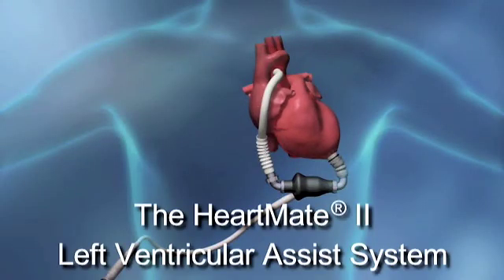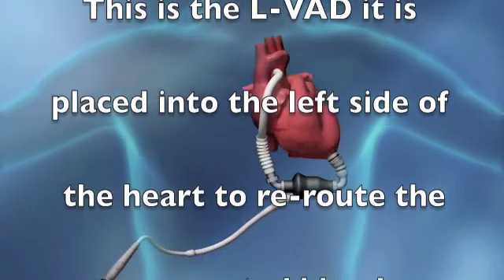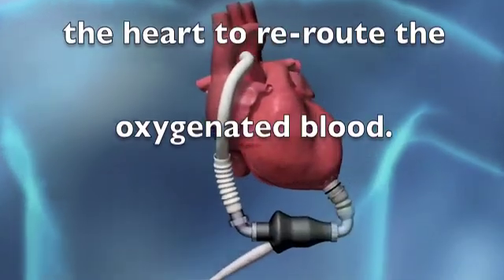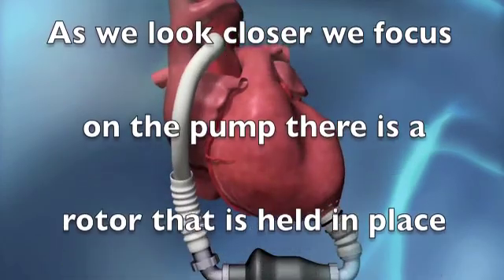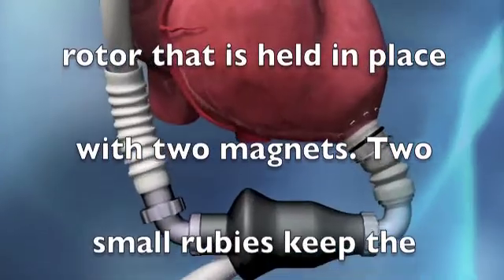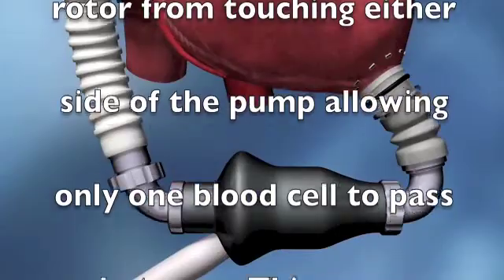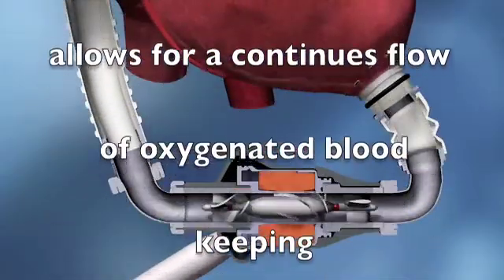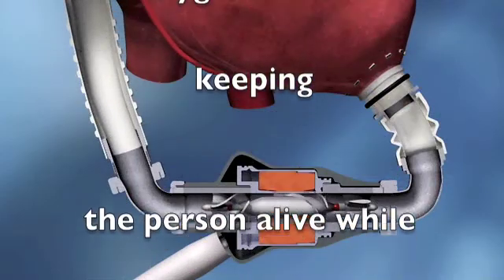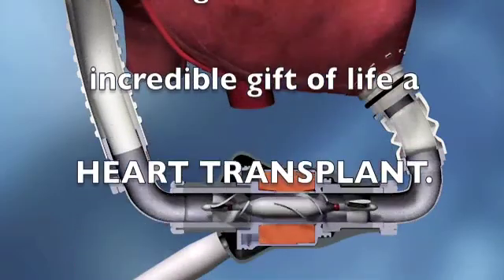The HeartMate 2 left ventricular assist system. This is the L-VAD. It is placed into the left side of the heart to reroute the oxygenated blood. As we look closer, we focus on the pump. There is a rotor that is held in place with 2 magnets. 2 small rubies keep the rotor from touching either side of the pump, allowing only one blood cell to pass between. This pump allows for a continuous flow of oxygenated blood, keeping the person alive while waiting for the most incredible gift of life, a heart transplant.